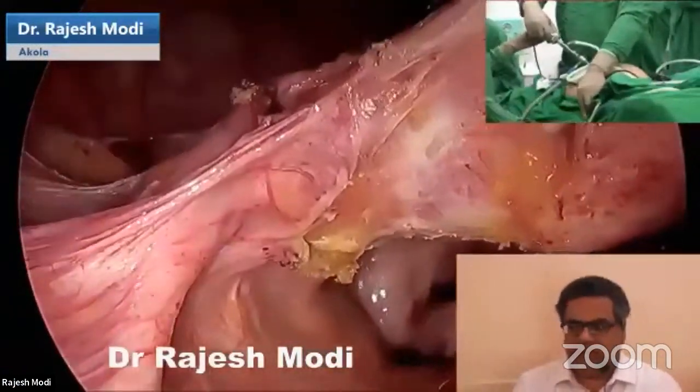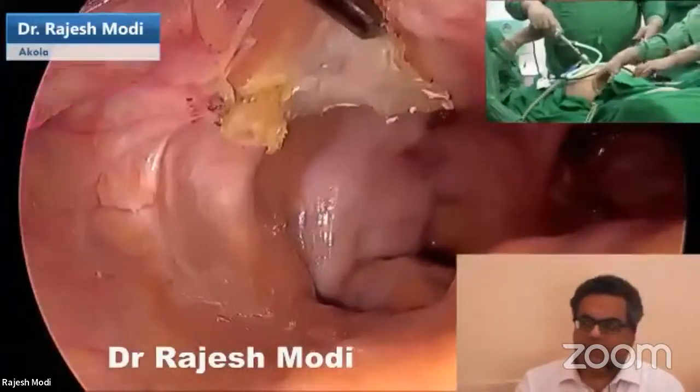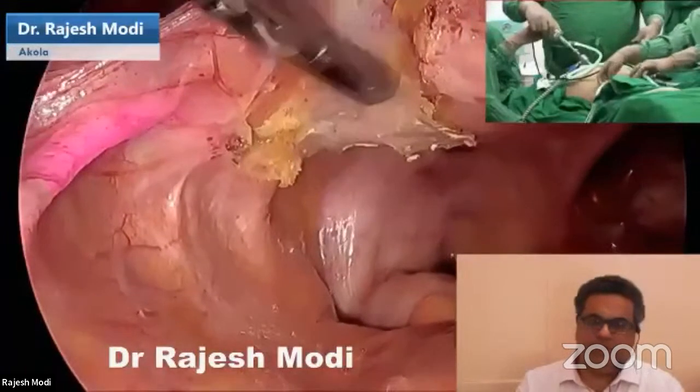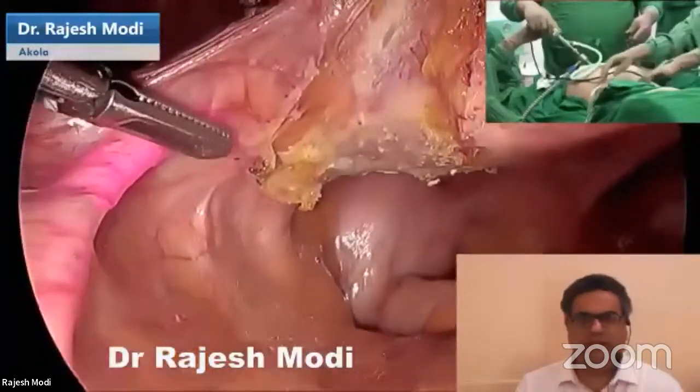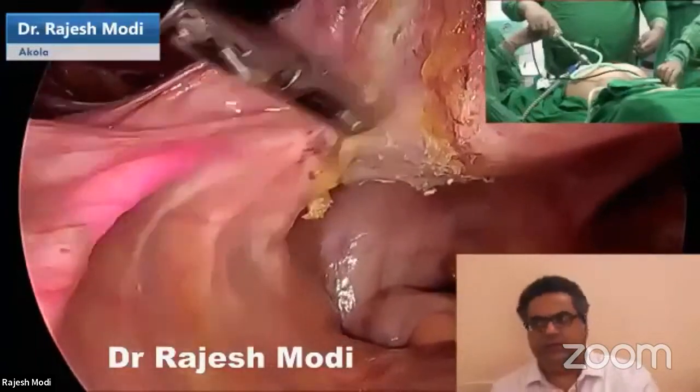Now, this is one of the latest systems where you can see the ureter with a glow catheter. So here you can see the posterior leaf of the broad ligament separated, uterosacral separated. The ureter falls back the moment I have separated the uterosacral.